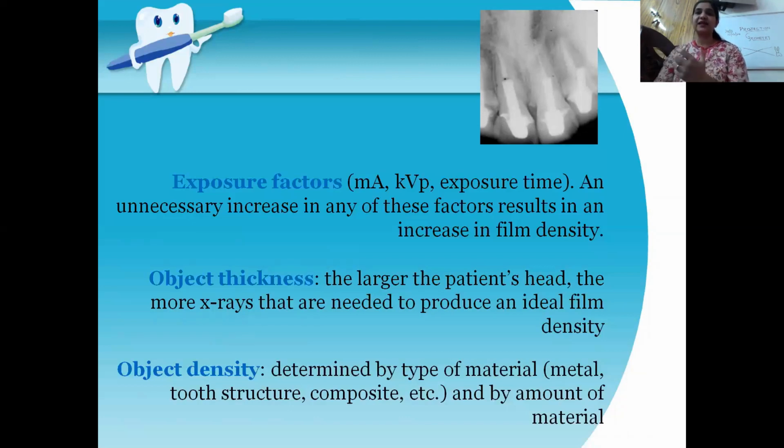And for object density, if there is restorative material such as composite, depending on the amount of material used, we should adjust the exposure time, mA and kVp accordingly, and then take the radiograph.